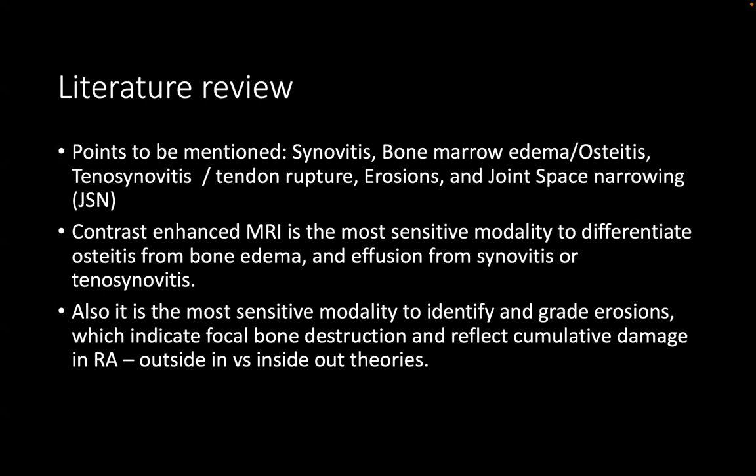Contrast-enhanced MRI is the most sensitive modality to differentiate osteitis from bone edema and effusion from synovitis or tenosynovitis. Hence, in newer studies, it is recommended that contrast-enhanced MRI should be performed at least in active patients of rheumatoid arthritis. Also, it is the most sensitive modality to identify and grade erosions, which indicate focal bone destruction and reflect cumulative changes in RA.